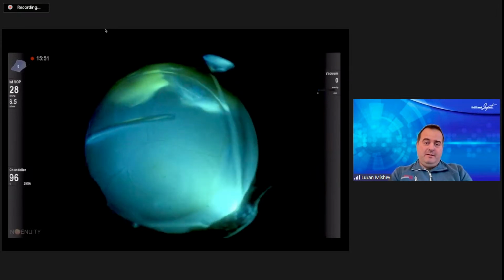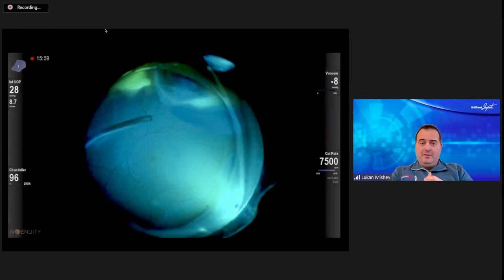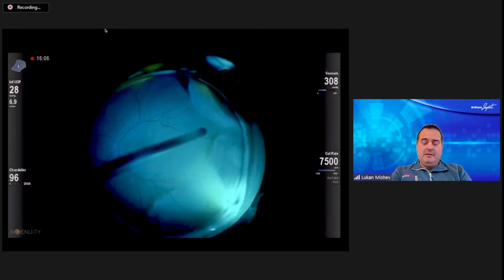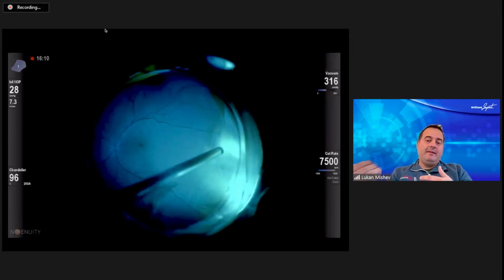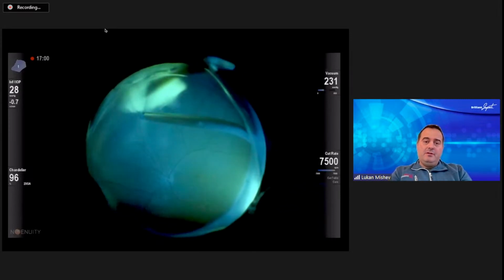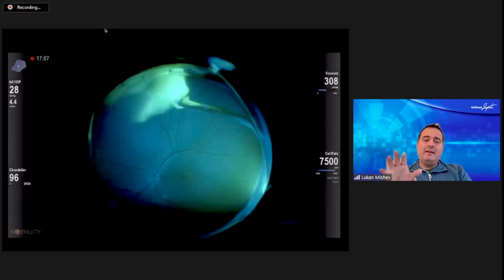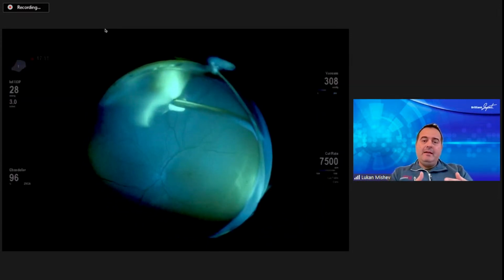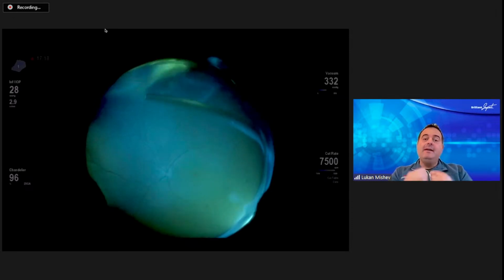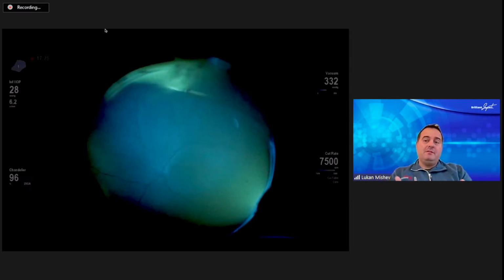And now you see here, in this combination with digital filter and the excitation light, I see quite well even the hyaloid. I can see perfectly well the vitreous and the vitreous base, and it is done under chandelier illumination, so I can indent myself. Again, I work, I do believe, quite precisely here. So you can see the stained vitreous, and for me the most important thing is that we can see the underlying retina. As Alan showed, cleaning the membranes which are stained will be even better if we are able to visualize the underlying retina better, so we can remove the membranes without possibly inducing damage to the retina.